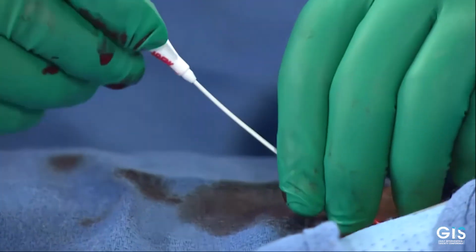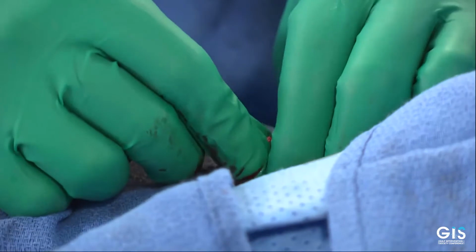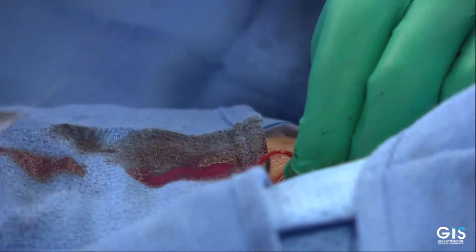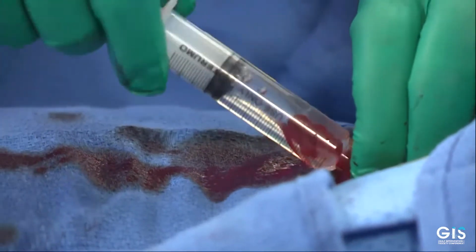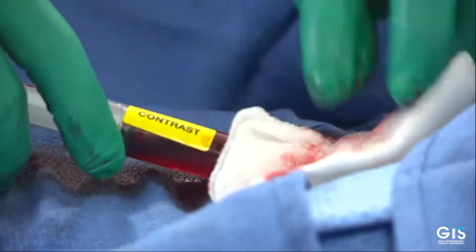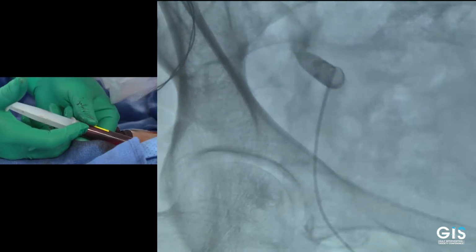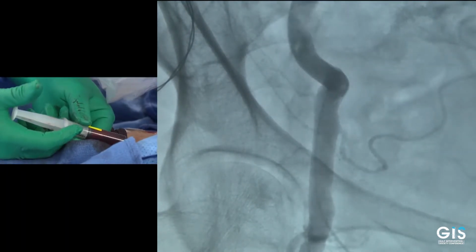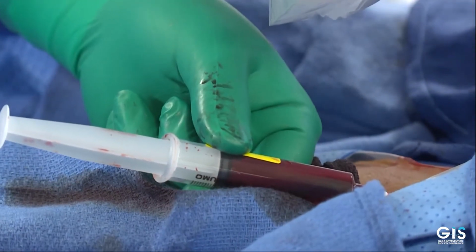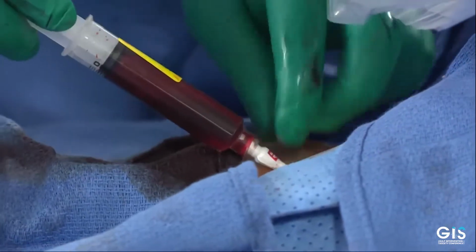Okay, so you screw it in just because the tensile strength is not very strong. And then, as you can see, the blood flowing, and you connect a contrast syringe to it to determine the location. So then we take a cine of the angiogram determining the entry point, and as you can see, we have a very good entry point in the upper third of the femur head and also central position. So we have a very good spot.